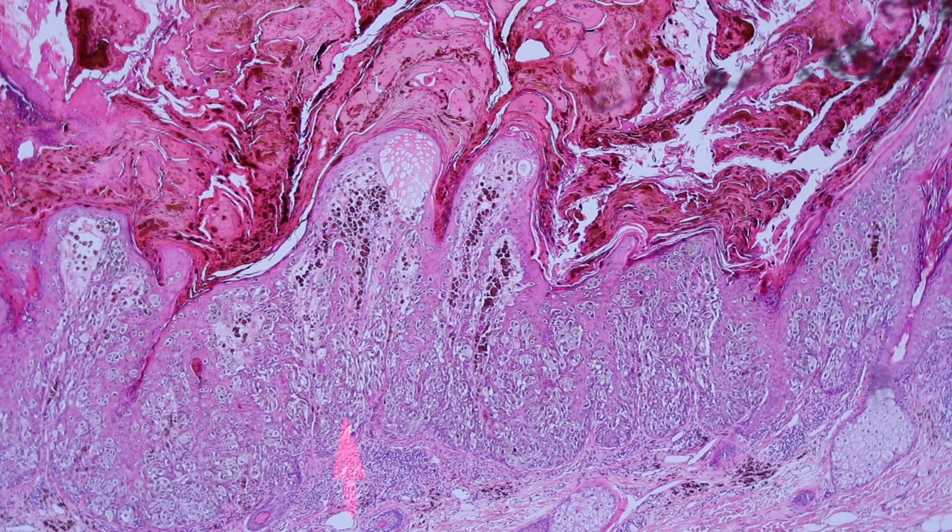So I think it's important to just remember that these are general guidelines, and when you see these things, stop and think about melanoma, but you have to put the entire microscopic picture together, all the different data points, and you have to put together the clinical scenario and make sure it makes sense. Is it a 1-year-old baby? Then it's probably not a melanoma. It's not that little babies can't get melanomas. They are extremely rare, but it has been reported, okay?